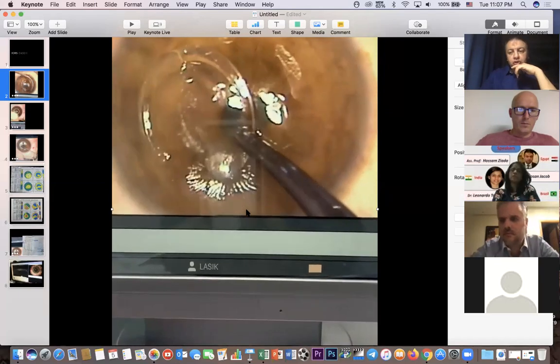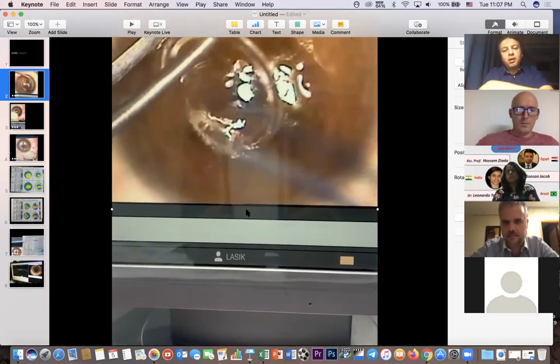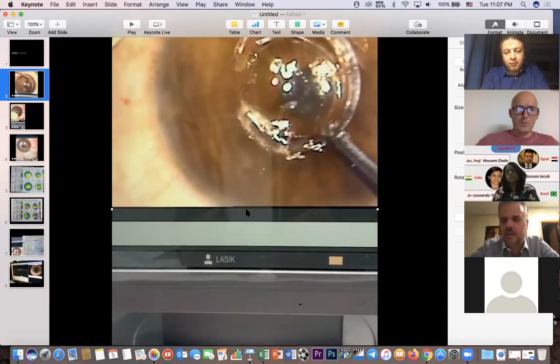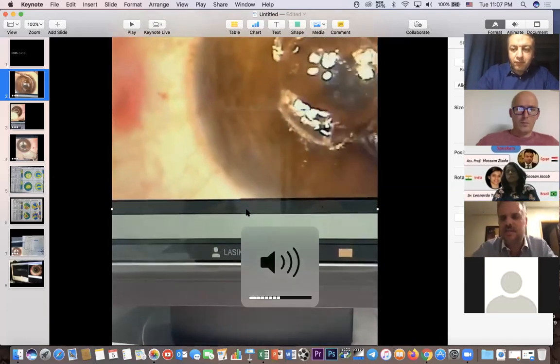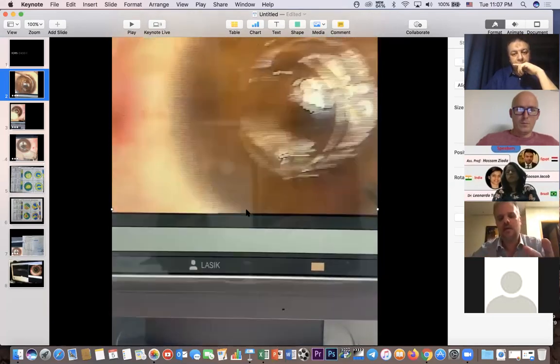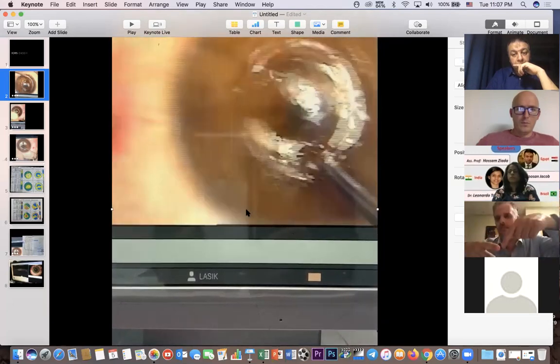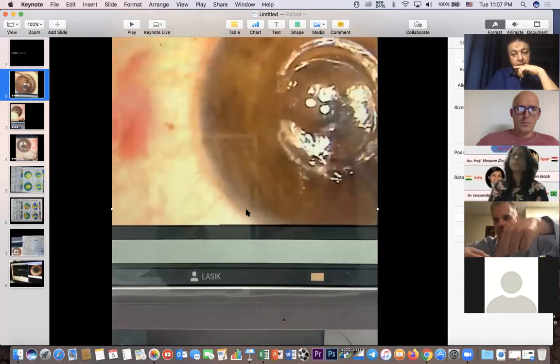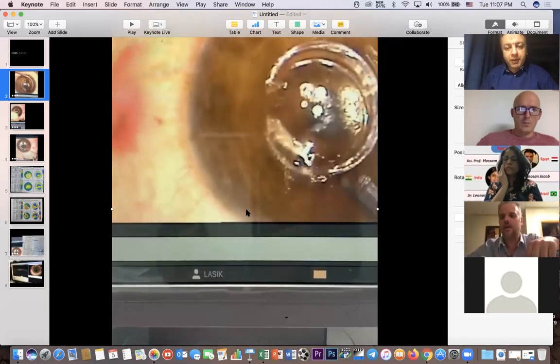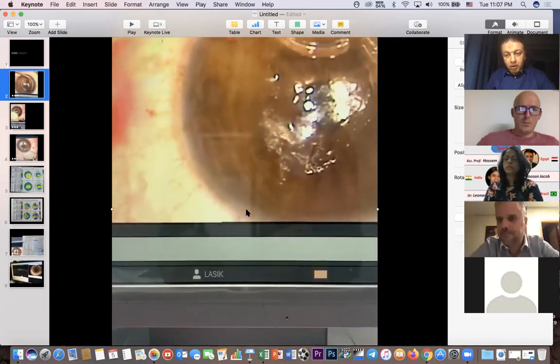So I tried to dilate the tunnel, which was made with a femto laser, with the manual dilator. I have had problems like this when the cornea is very steep in the inferior part, and sometimes when you are introducing the ring, you are in an area where the cornea is very thin and it blocks. What I do in this case, I push the cornea with my finger to make the ring go through. The ring goes like this, and then I push with my finger to put it in. I have sometimes this problem.